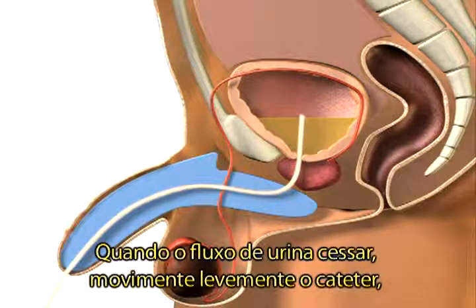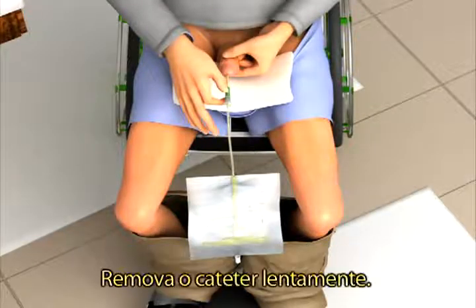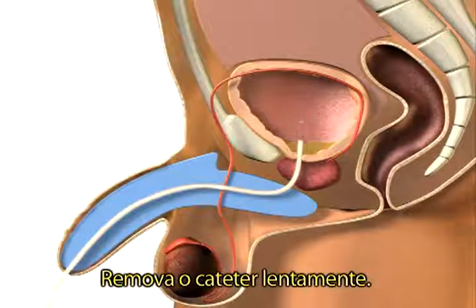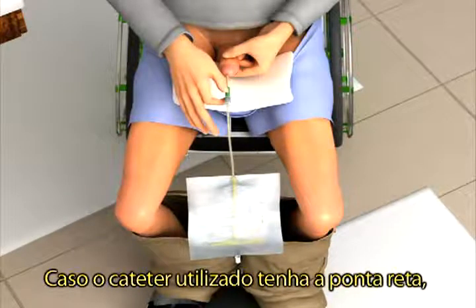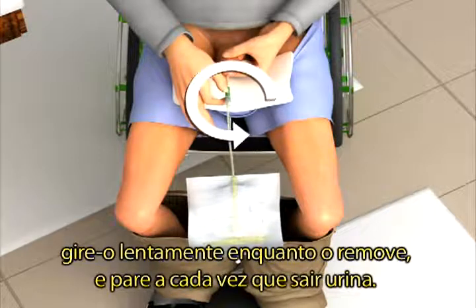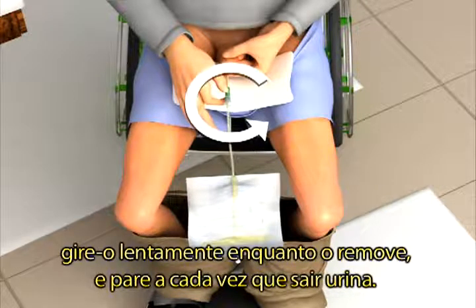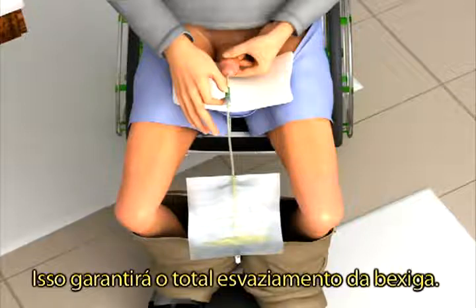When the flow stops, move a little and straighten yourself up to make sure that the bladder is completely empty. Then slowly remove the catheter. If you use a regular catheter with a straight tip, it is recommended that you slowly rotate the catheter as you withdraw it and stop each time more urine drains out. This is to ensure complete emptying of the bladder.